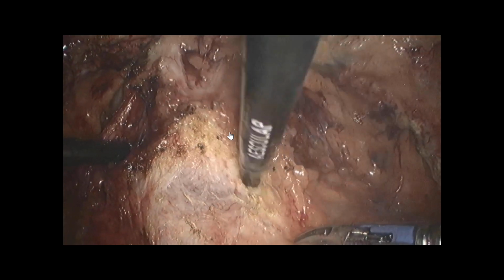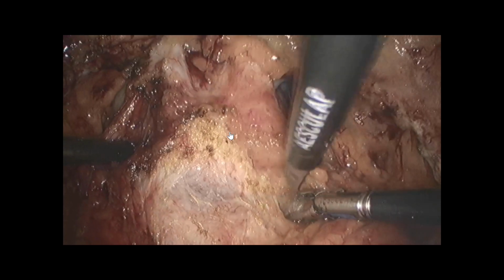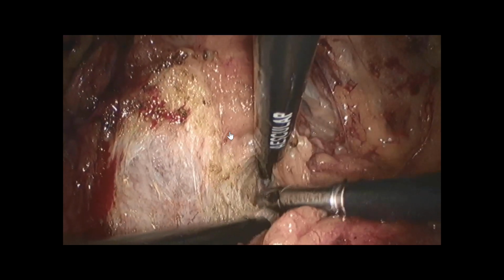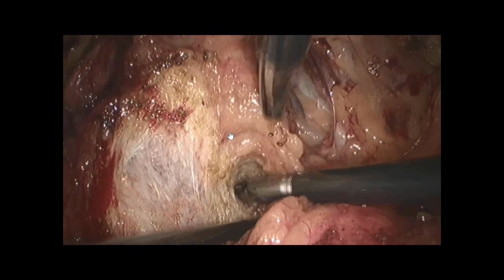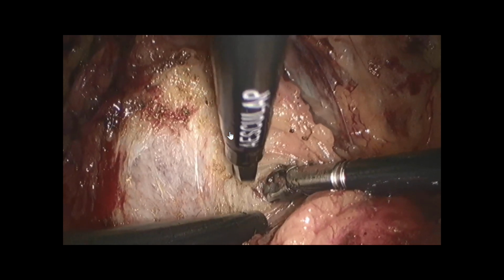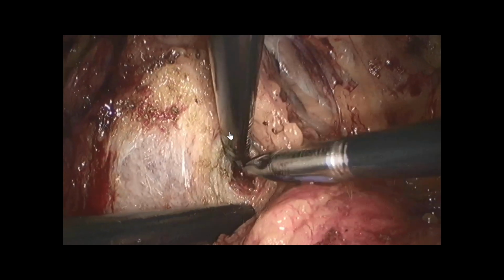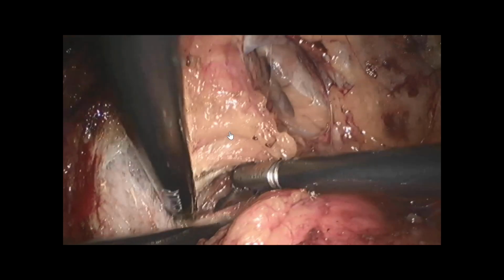And you see that slowly you can just try to find the good space, and slowly I will go laterally to find this space laterally. So for this, what is important is to let in the balloon only 3 cc of water, not a big part. And you see here slowly with traction and countertraction.